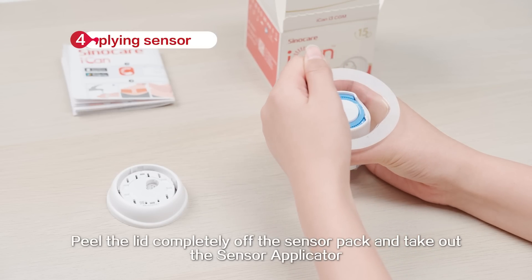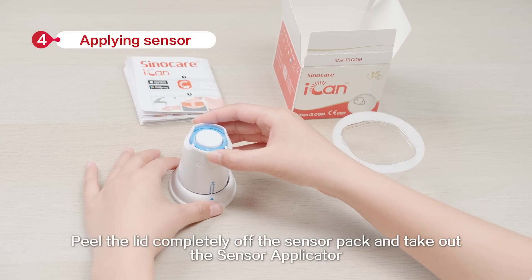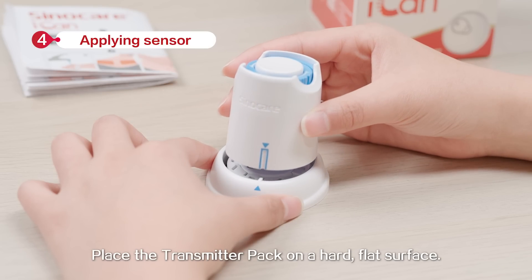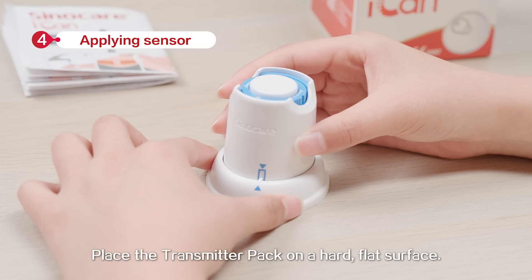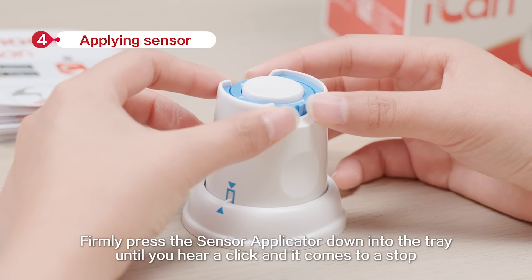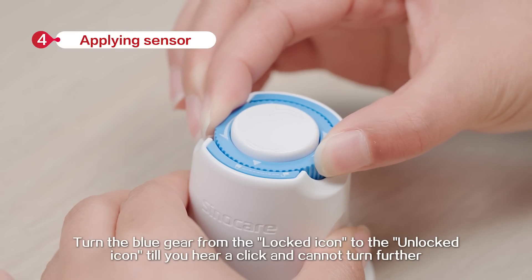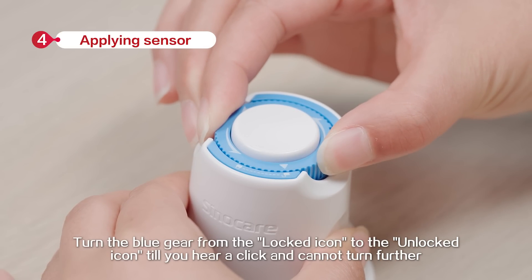Peel the lid completely off the sensor pack and take out the sensor applicator. Place the transmitter pack on a hard flat surface. Line up the blue mark on the sensor applicator with the mark on the transmitter tray. Firmly press the sensor applicator down into the tray until you hear a click and it comes to a stop. Turn the blue gear from the locked icon to the unlocked icon until you hear a click and cannot turn further.